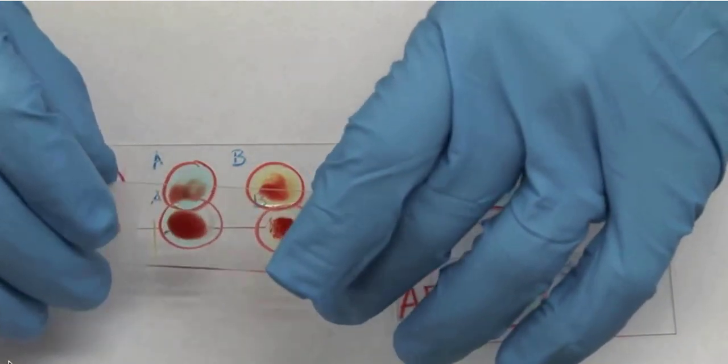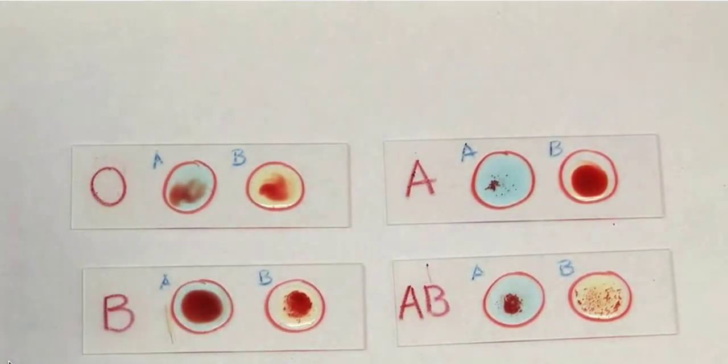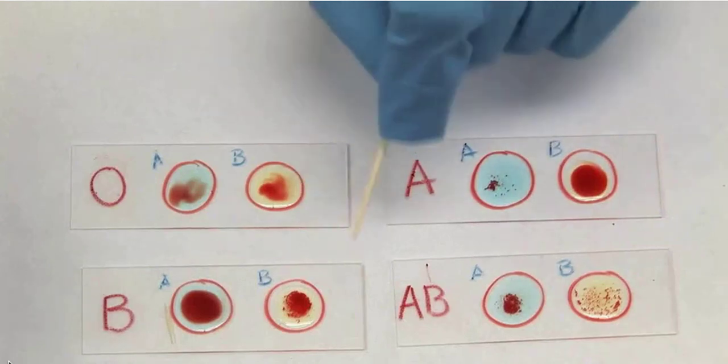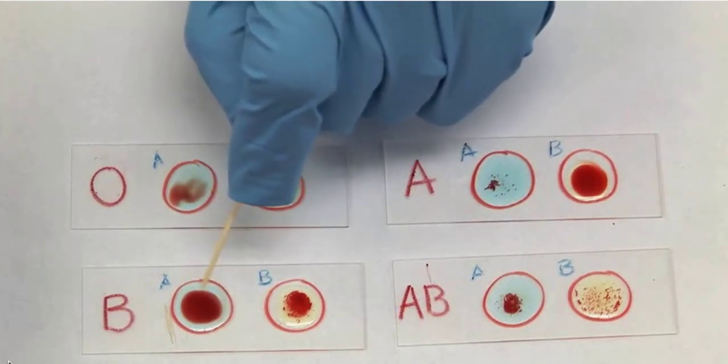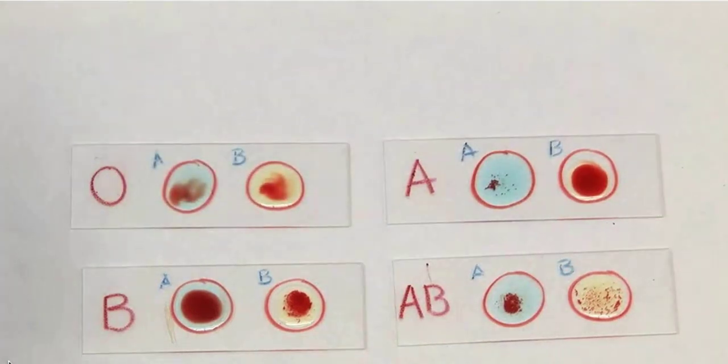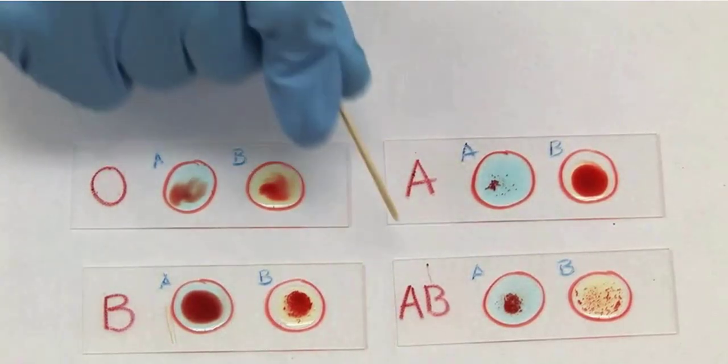So it's more clear with a little mixing that we have agglutination or clumping in the antiserum for B, but no apparent agglutination in the antiserum for A, thus this person is labeled type B. So those are the 4 blood types: type O, type A, type B, and type AB.